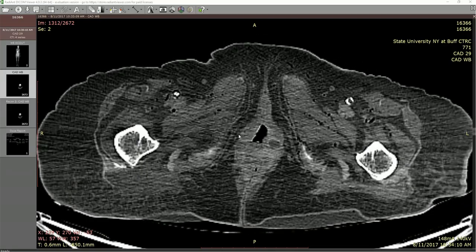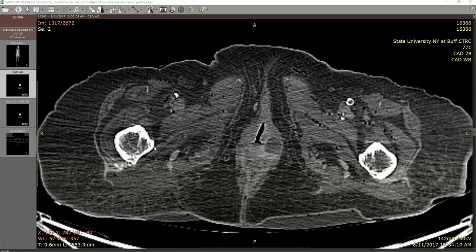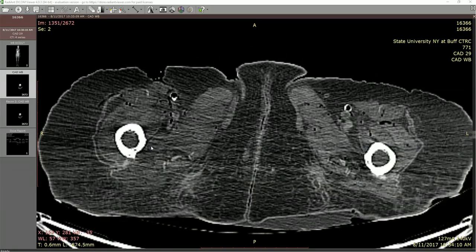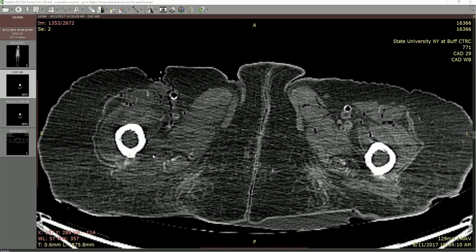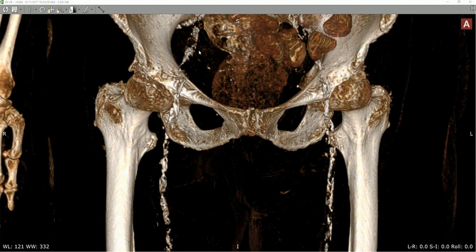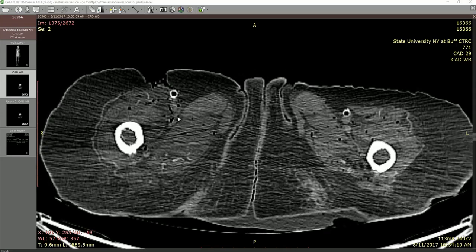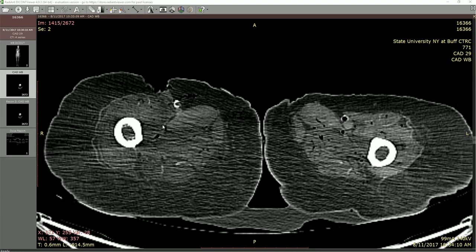Scrolling down a bit, we see the lesser trochanter on the femur, taking us into the femoral shaft. The linea aspera is going to start to become prevalent on the outside here. Here's our anterior muscle group and medial muscle group just starting, and then our posterior thigh muscles on the back side. Something interesting: as I mentioned earlier, we have a lot of calcification within the femoral artery in particular, which allows us to fairly easily trace it as we go through the CT image. Keep an eye on that as we continue to scroll down — you're going to see it start to migrate over a little bit.